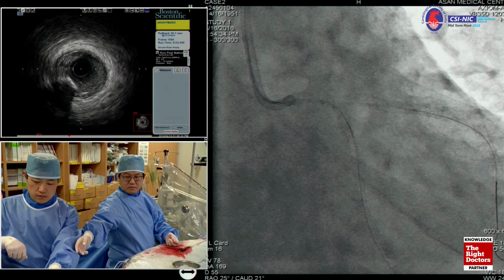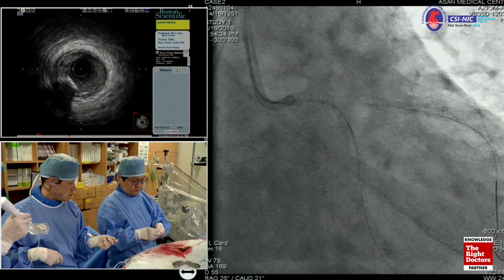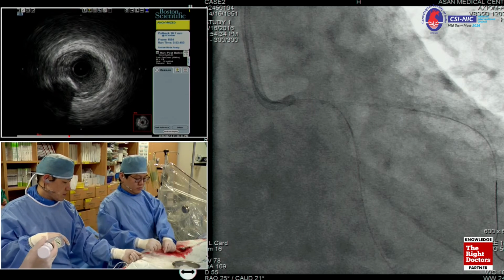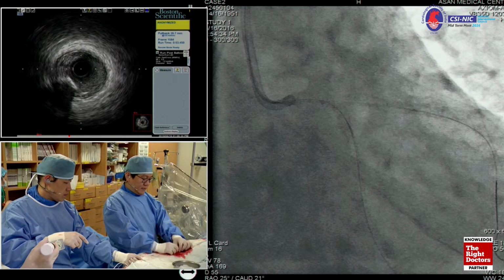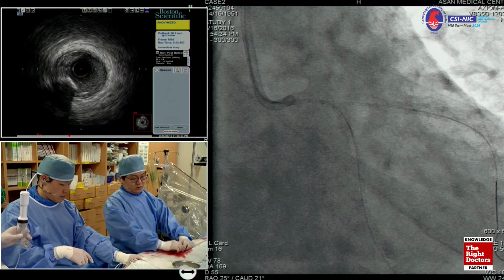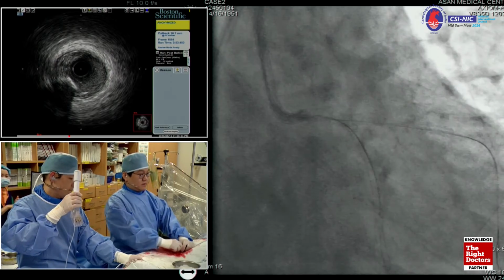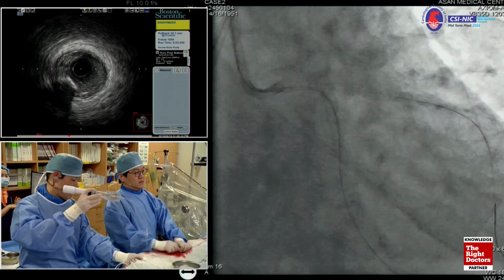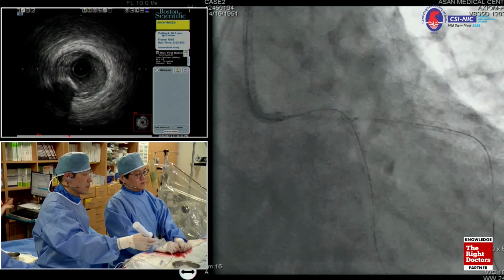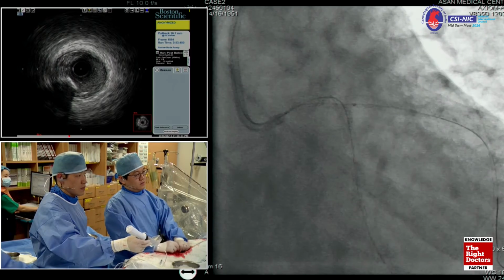So Dr. Han, you did the predilation with a smaller balloon in the circumflex ostial area, 2.0 or 2.5 before? Yes, for the circumflex opening, the 2.0, and then the 2.5 balloon; we gradually increased the balloon dilatation for the circumflex stent. But the 2.75 NC balloon could not pass yet. Yes. So this is for the LAD. Is this new one? It's not new, I used to use.